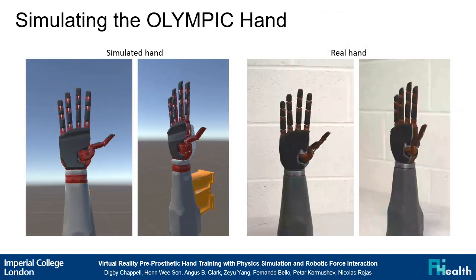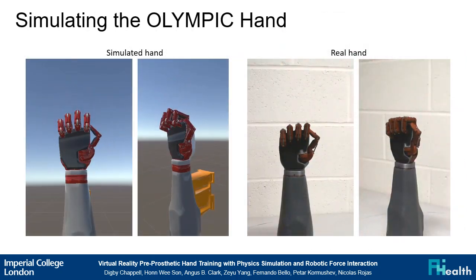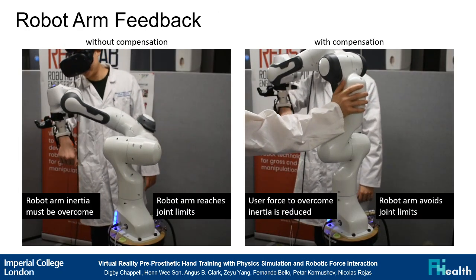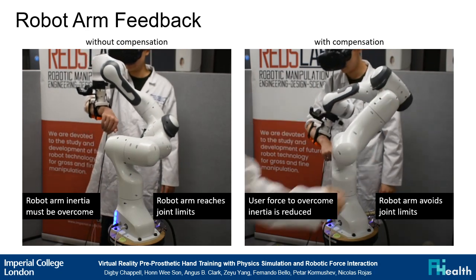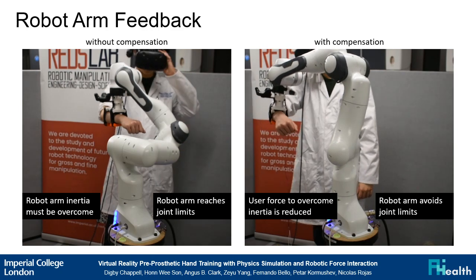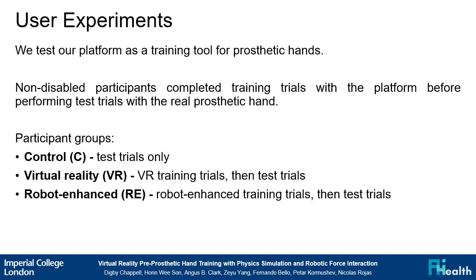To achieve this, we have accurately simulated a tendon-driven prosthetic hand, and utilized an external robot arm to provide accurate force feedback from the simulation. Compensation prevents the arm from reaching its joint limits and counteracts inertia. Non-disabled participants completed training trials with the platform before performing test trials with the real prosthetic hand. A control group performs test trials only, a virtual reality group performs training in VR before testing, and a robot-enhanced group performs training with the proposed platform before testing.